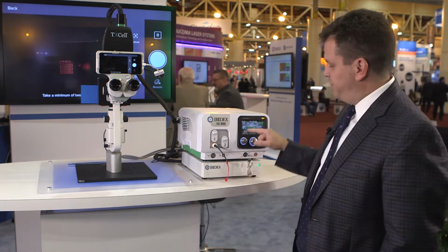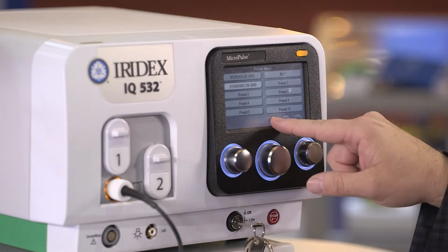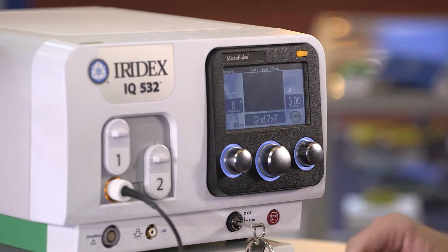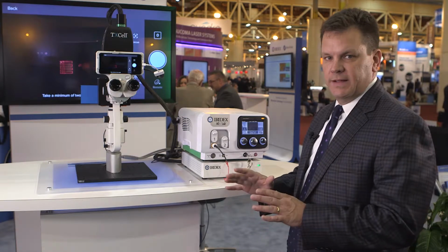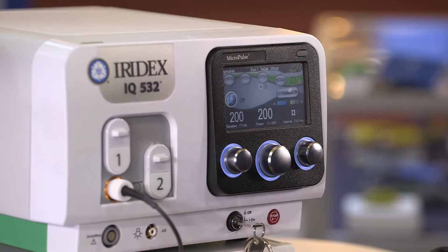The first, we're going to put the laser in a continuous wave pattern, the standard continuous wave grid, and you'll notice that we're treating at 200 milliseconds of duration and 200 milliwatts of power. We're also putting in 7x7 pattern scanning technology with spacing out at 3 as we're doing a PRP treatment in the retina. Put the laser in treat mode. We're going to fire the laser.